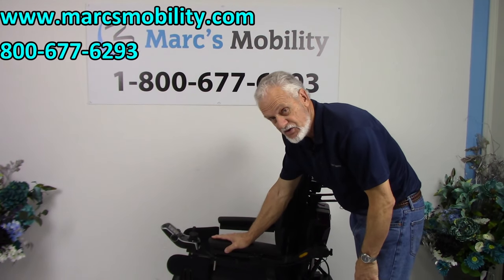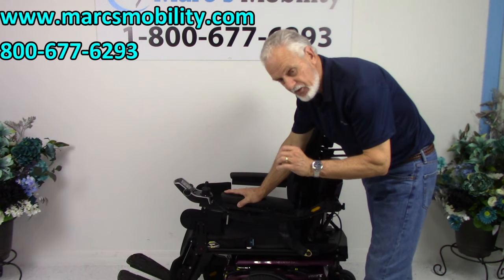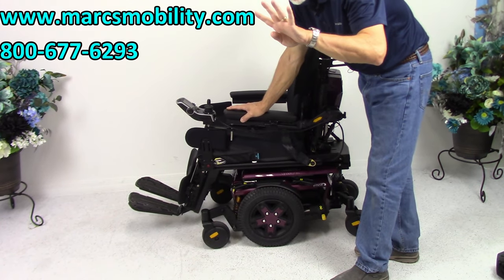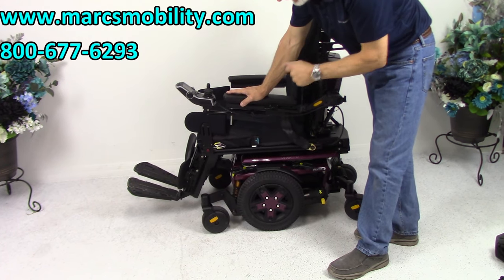This is a Quantum Edge 3, the newest in the new line of power chairs from Quantum Pride Mobility. This power chair has four miles on it, so it's practically brand new, as you can see — four miles.